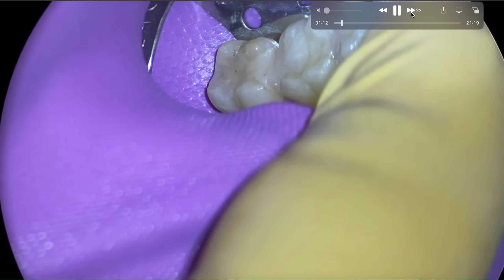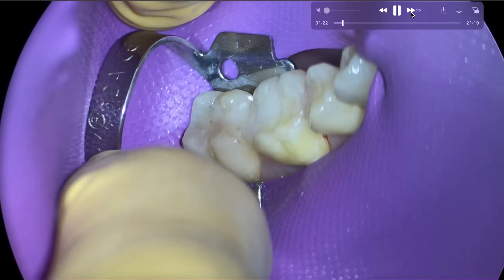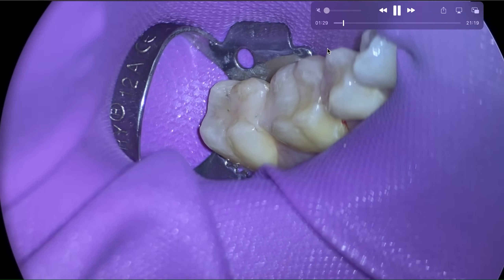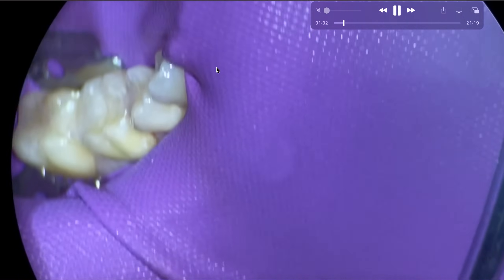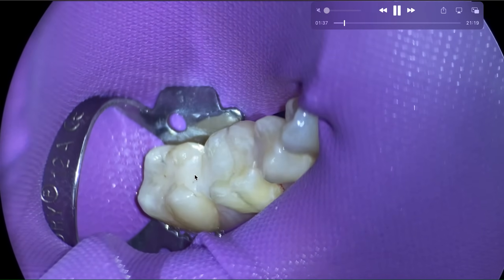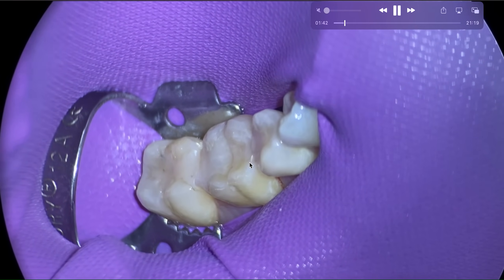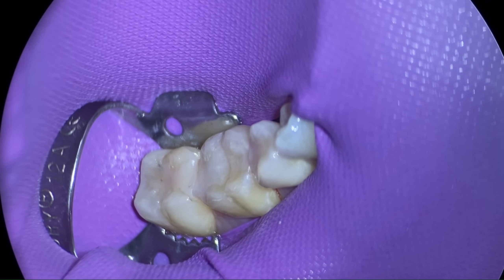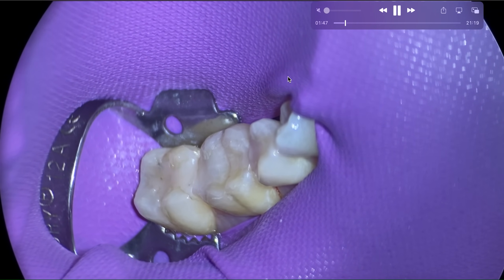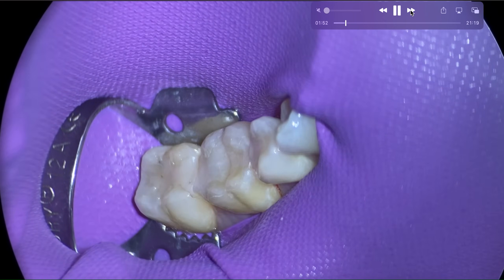I'm extracting this tooth with a rubber dam — it makes life so much easier. I've got to shout out to my buddy Nathan, who, since I showed him that video a long time ago, this is all he does — extract, not wisdom teeth. It's hard to extract wisdom teeth and put this on the coronoid process to get your rubber dam isolation. But for teeth you can put a rubber dam on — typically a 6, 5, 4 — rubber dam is really helpful. My dental assistant Christy did it for the first time, and by the end of it, it was so much easier.